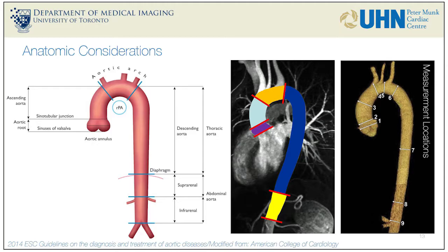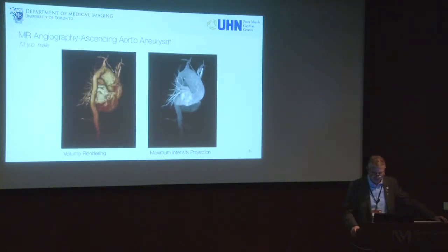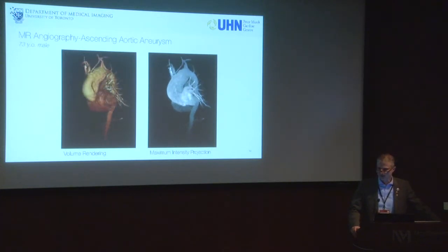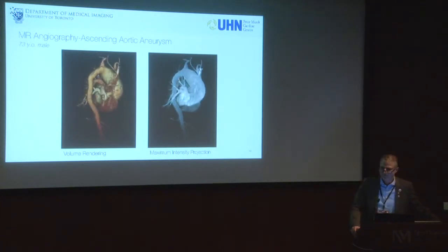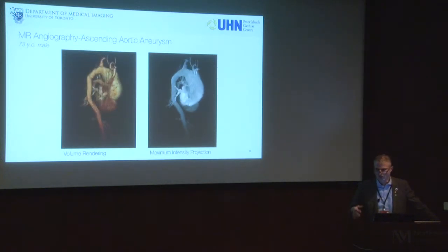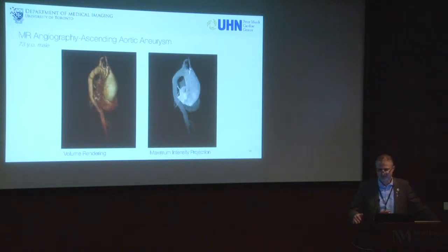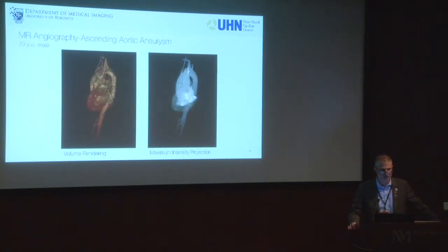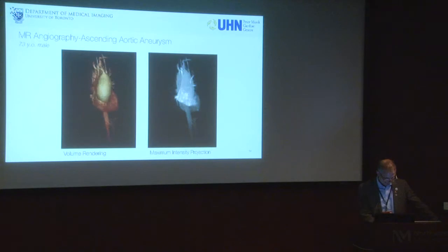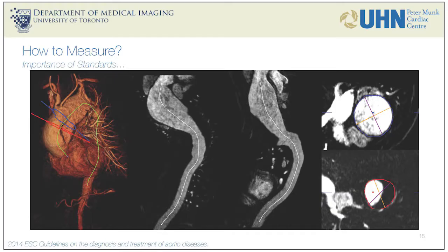Coming to those images, we have seen nice data about the different ways you can present data. This is something that's very nicely shown to patients and also appreciated by the surgeons because they get an overview of what's going on there. In terms of reporting, those images are not necessarily very helpful because you can't do really good measurements of those data sets. But using the same data sets, you can certainly do a couple of different approaches.